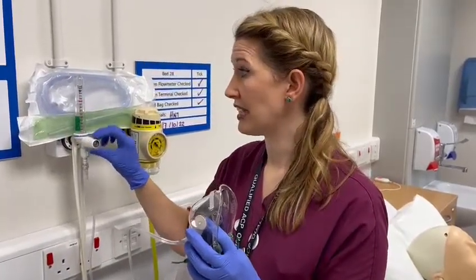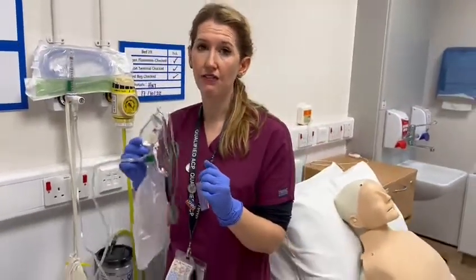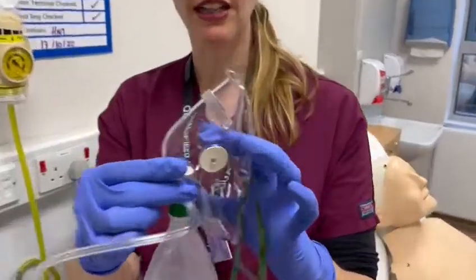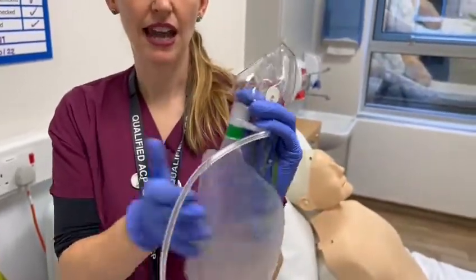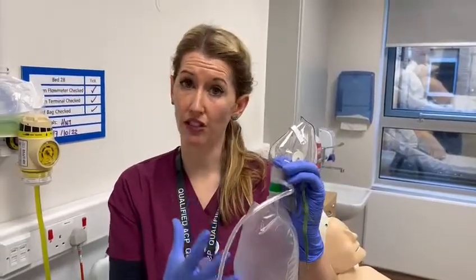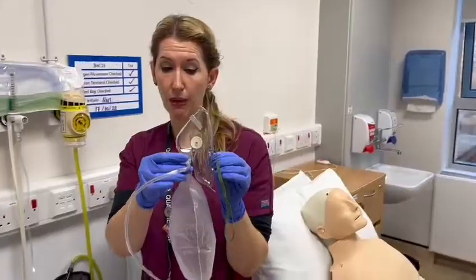So we switch that up to 15 litres. We want to make sure that our oxygen delivery device actually works, and the way we do that is by occluding these valves here, making sure that the bag fills up and then deflating it, and then refilling it again — and that's to make sure that this reservoir bag works as you'd expect. I now know this is safe to administer to my patient.